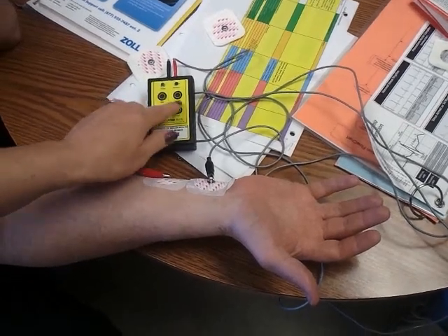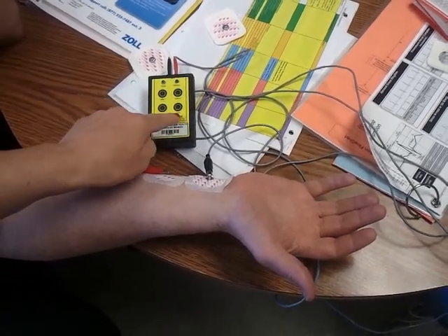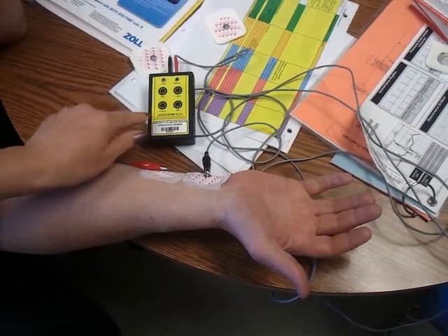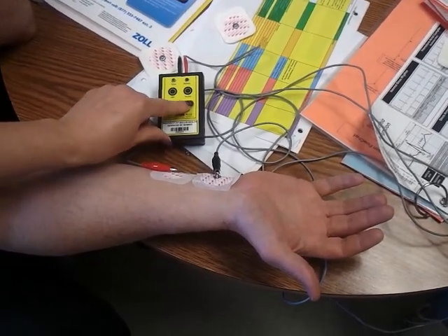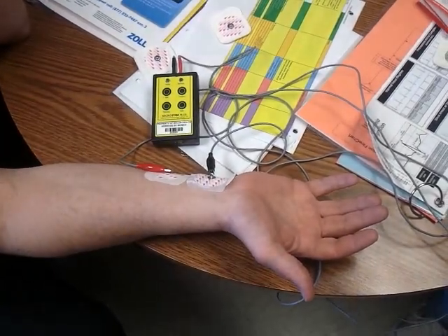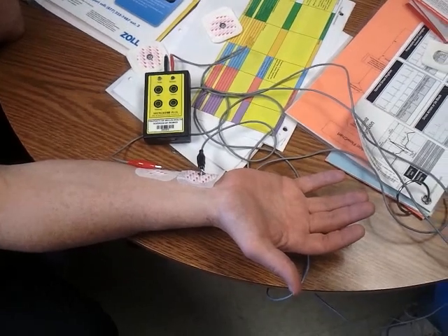There's four modes that you can do on here, but we're just going to do the TOF Train-of-Four. Okay, so we just hit the button. We're on level one. It will give us four pulses and we didn't see anything.